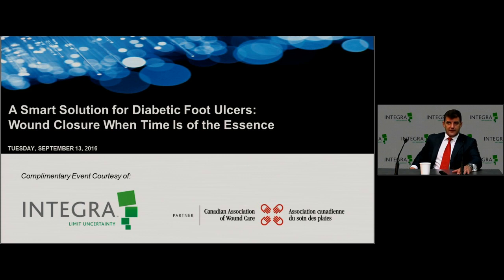But also for venous stasis ulcers, it can be very useful. But I would say the thing with venous stasis ulcers is that in general, they really warrant good wide debridement prior to using IDRT therapy, because a lot of what you see in a venous stasis ulcer looks very superficial, which is fine. You can epithelialize it and get the patient under control. But if it's really deep, that dermis is completely, and I've looked at this histologically, that dermis doesn't look like dermis, it's scar. And you should get rid of it and try to regenerate better dermis. So that's how we go about venous stasis ulcers.